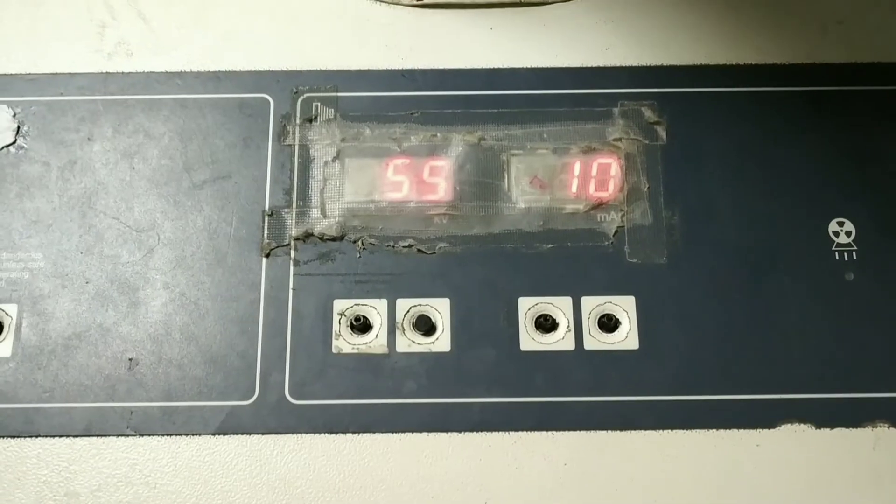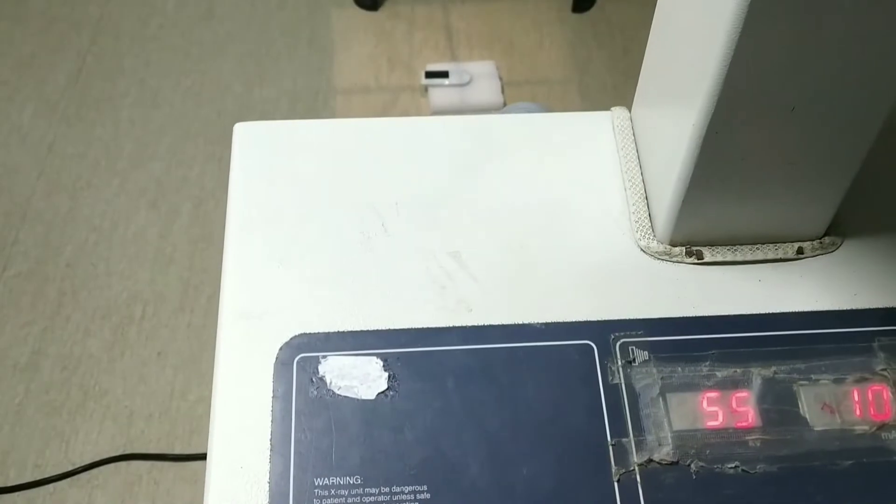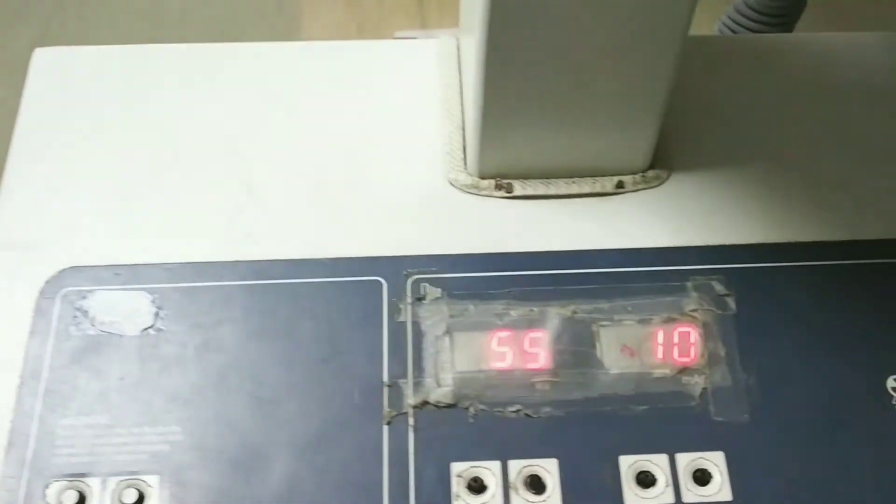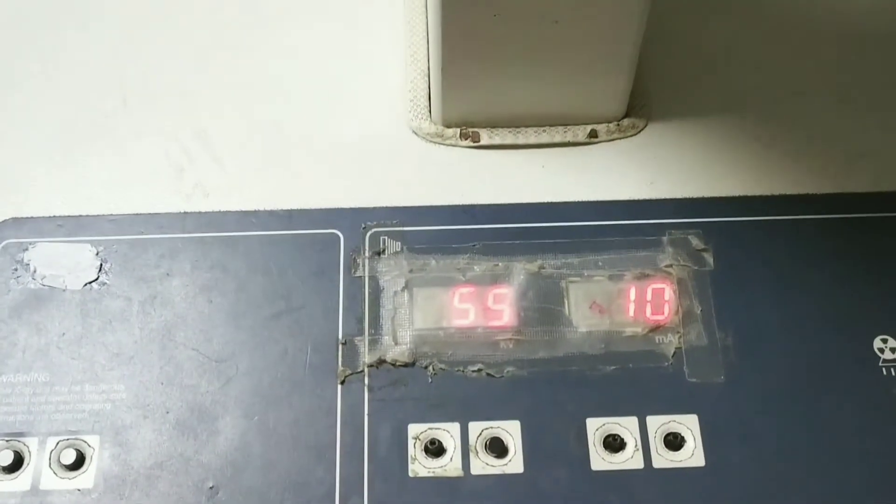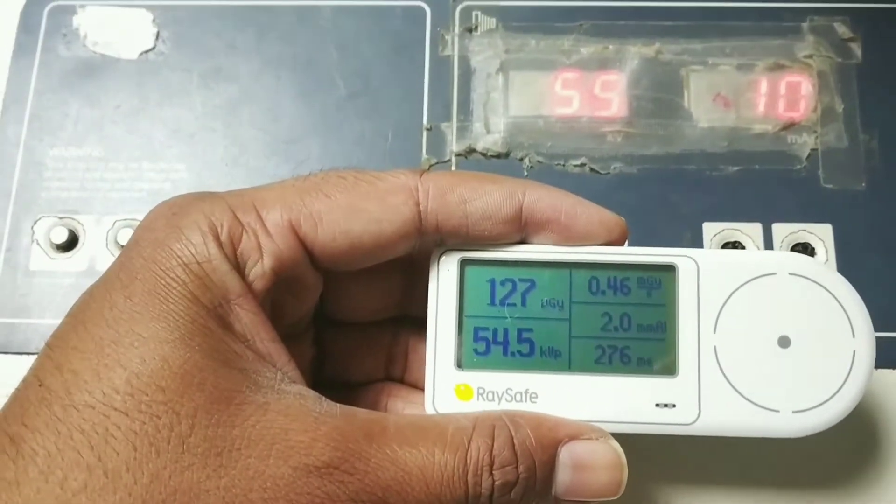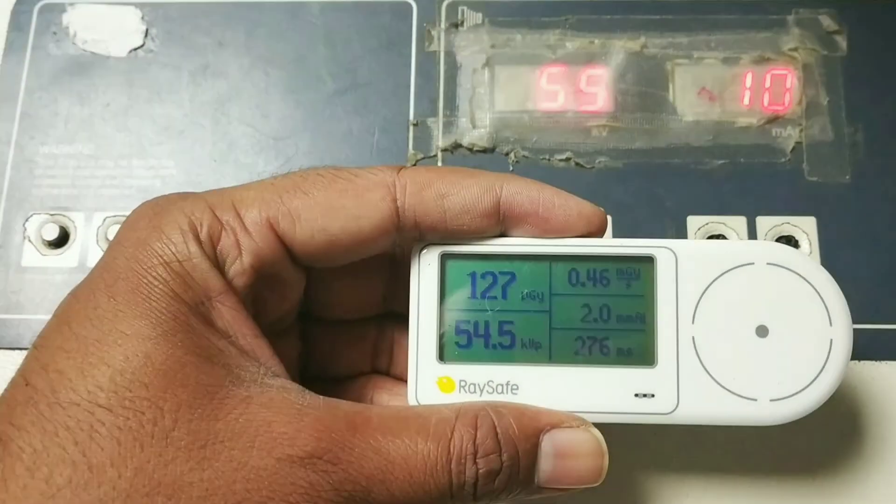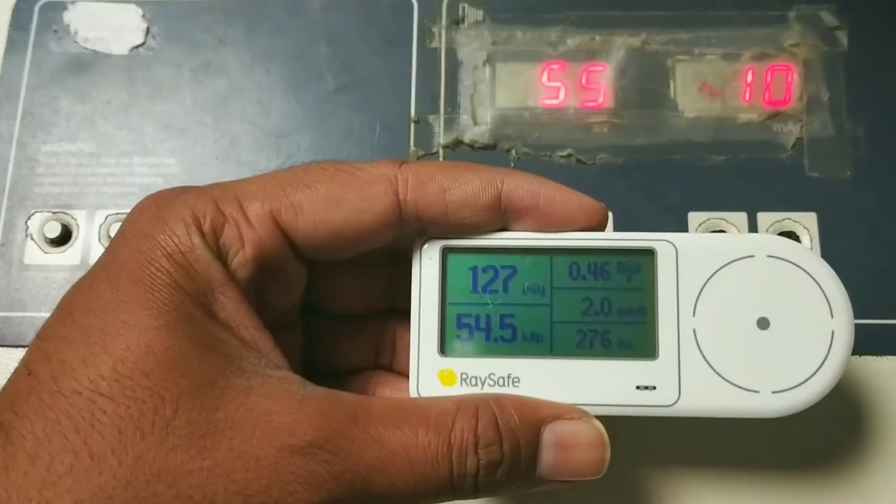Now we will be testing dose with the help of the dosimeter. This is the reading set. Now we will take a shoot. We'll check if there is a variation or not. You can see how the readings are related. With the help of different readings, the error percentage is calculated and it is checked whether it is correct or not.